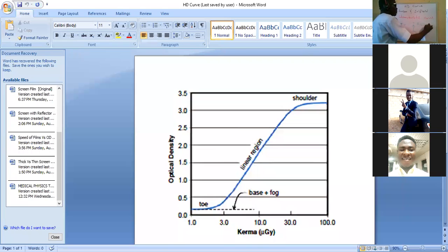0.11 to 0.15. That would be the base, the optical density of a freshly acquired film. Without exposing it, it still has some inherent OD in it. So without exposing the film, it has this value range. This value range is that for a newly bought, fresh film.